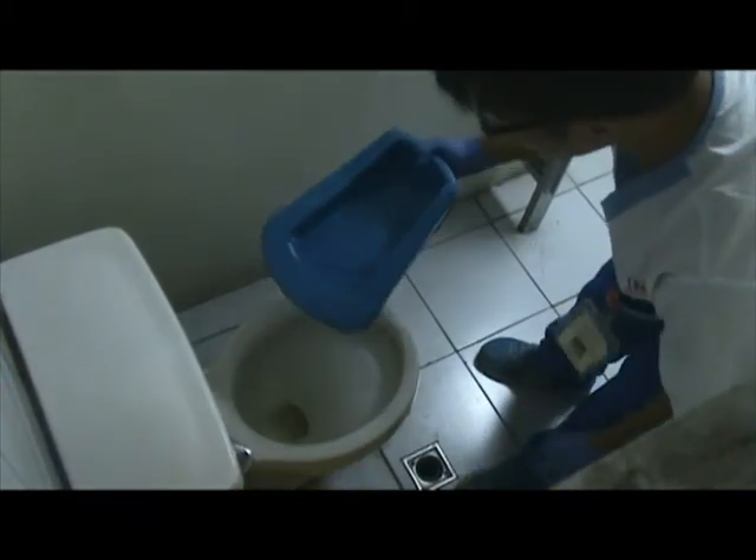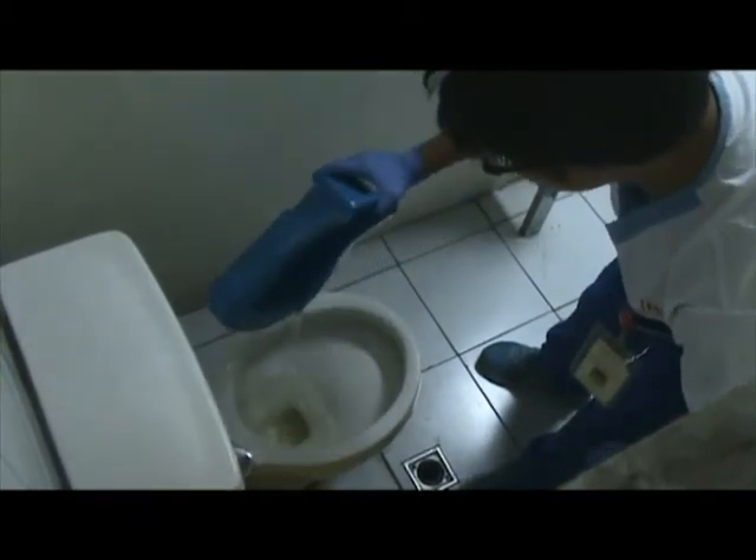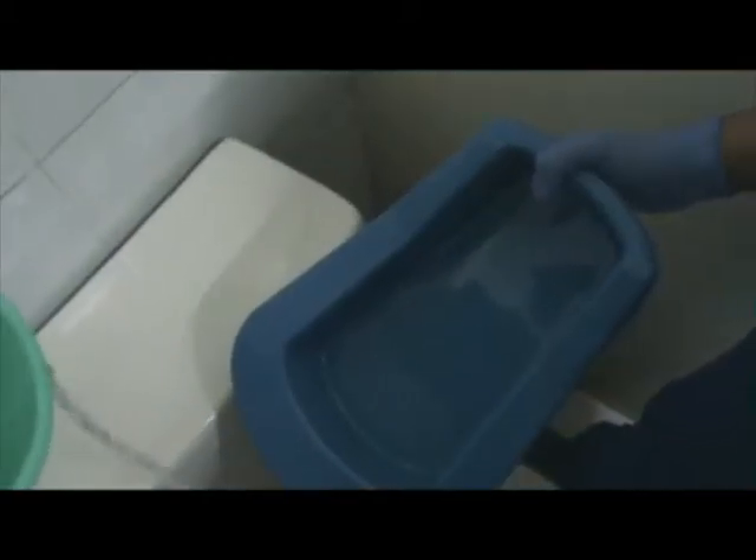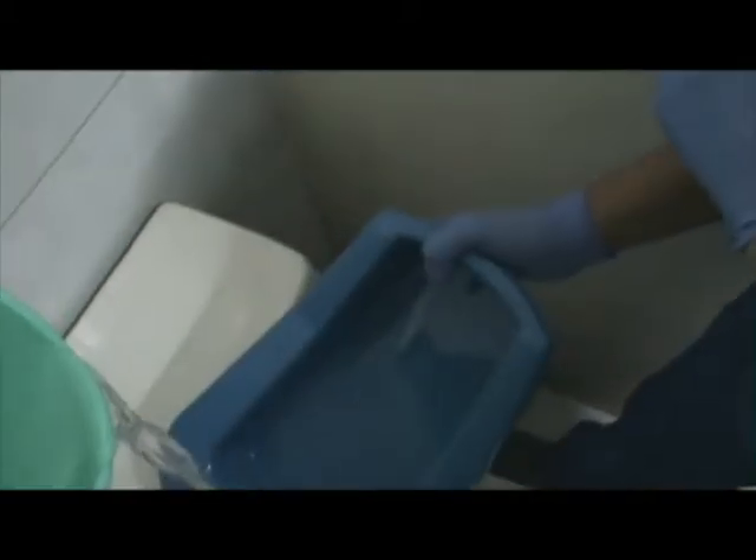After patient use, dispose and flush the contents to the toilet bowl. Rinse the bedpan urinal thoroughly with water until all visible soil contents are removed.